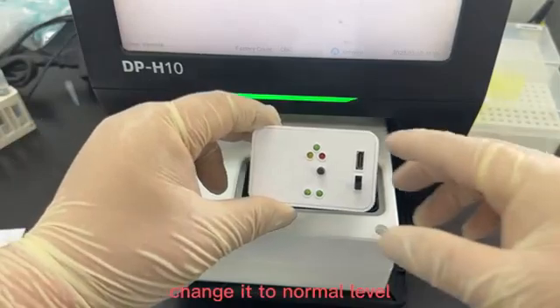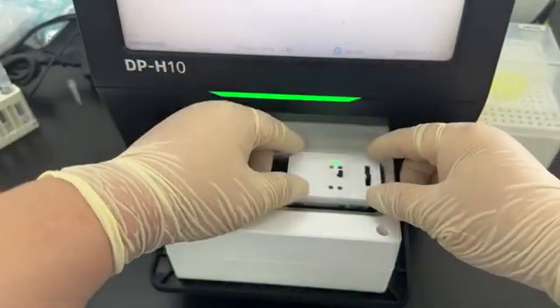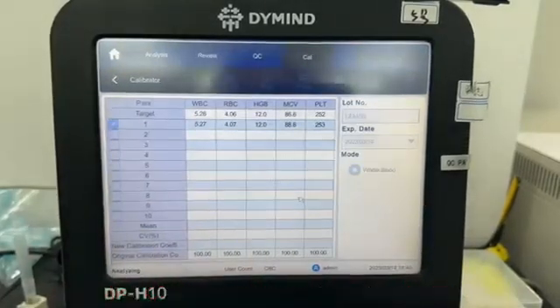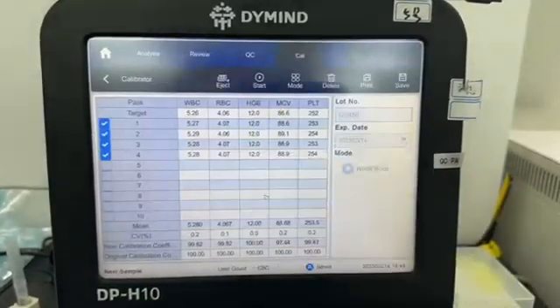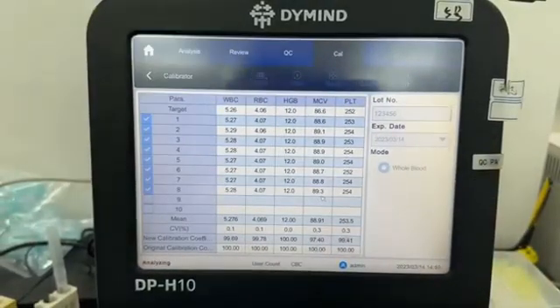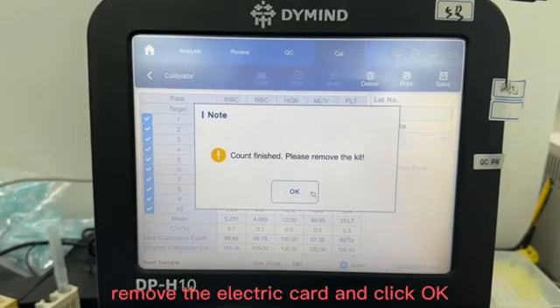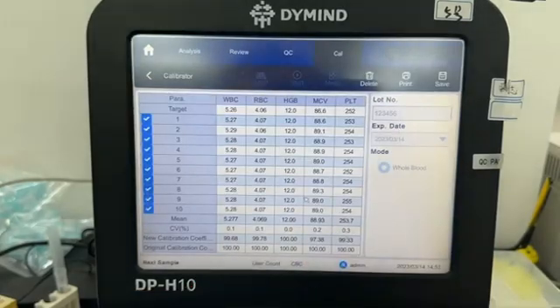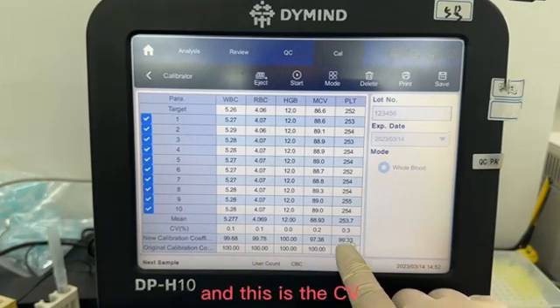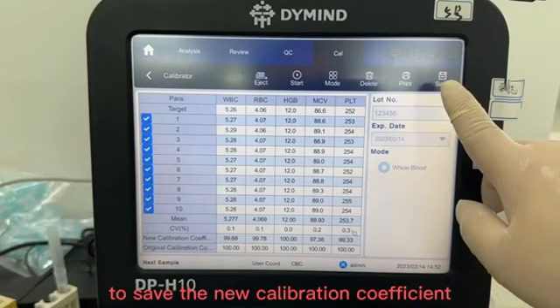Turn on the switch, change it to normal level, and put it in the testing box. Click OK — the machine will start to do the test. After the calibration is finished, remove the electric card and click OK. This is the new calibration coefficient. Check the CV; only if the CV meets the requirement can you click Save to save the new calibration coefficient.